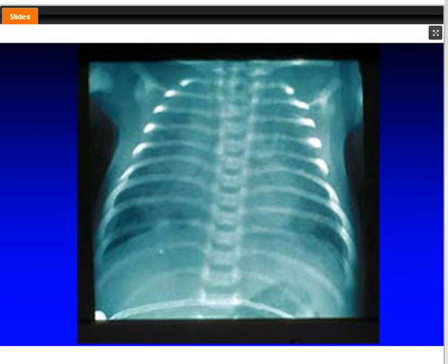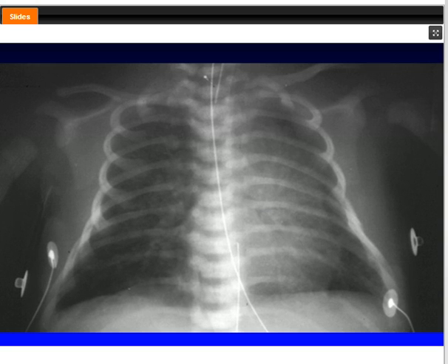He's got a pneumonia, and you don't have an adequate mean airway pressure in this patient because you have a lot of infiltrates and you have areas that need to get adequately inflated.